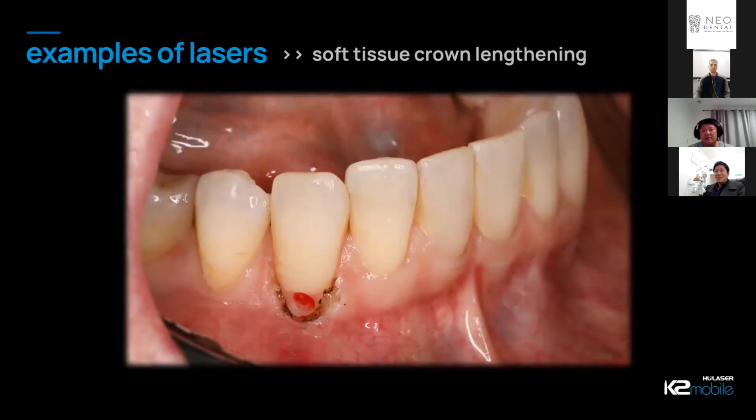This one here, deeper restoration. So you can kind of imagine where the gingival line used to be, and I used the laser just to go all the way around until I expose the margin of the decay, so I can visually see where the restorations need to end. Obviously, I'm not trying to teach you how to do dentistry, but an important consideration is knowing your biologic width and whether you're encroaching in that space. Fortunately, in this particular case, I told her from the start that it's not looking so great because that probe was just going deeper and deeper before I lasered everything off. Unfortunately, this one had external resorption, and so the endodontist claimed that we should remove the tooth and plan for an alternative replacement there.